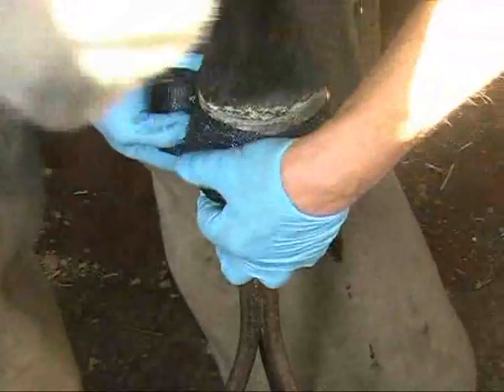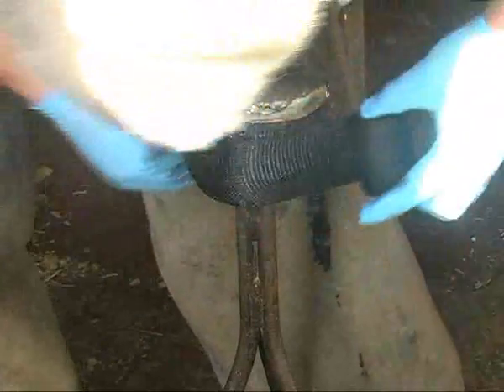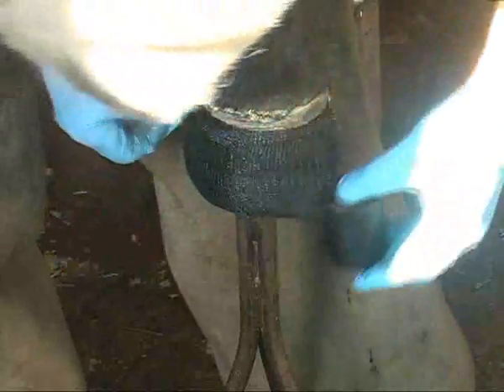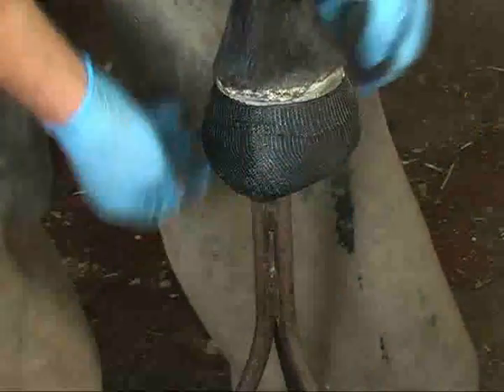Tighten it up as best we can. Try not to get any closer than that to the hairline. This is some really fast-setting adhesive I'm using — I've got quite slick at this job. Now and then we can use the fast-set adhesive, whereas before we used the slower stuff. I'll be able to put the water on to set the bandage off.